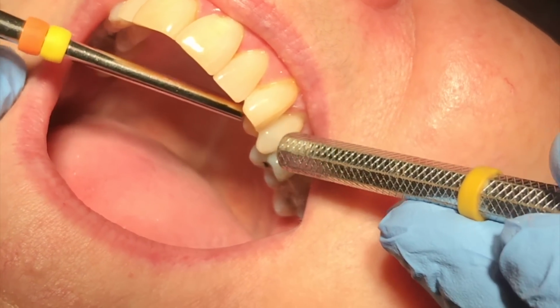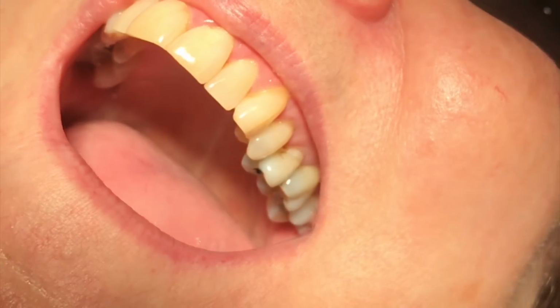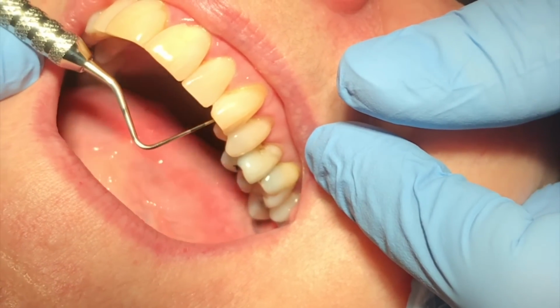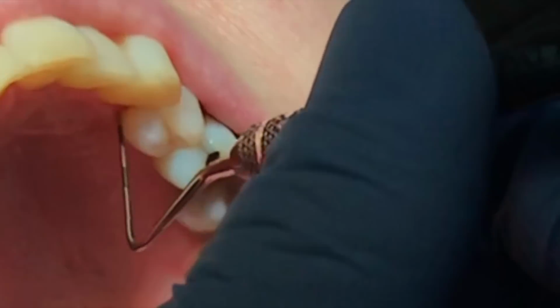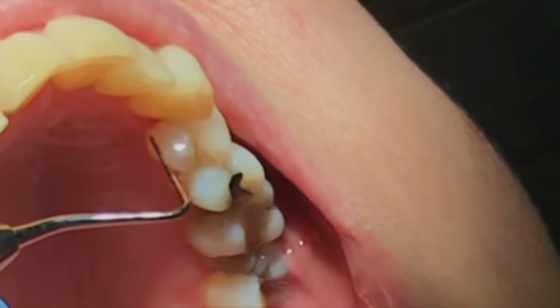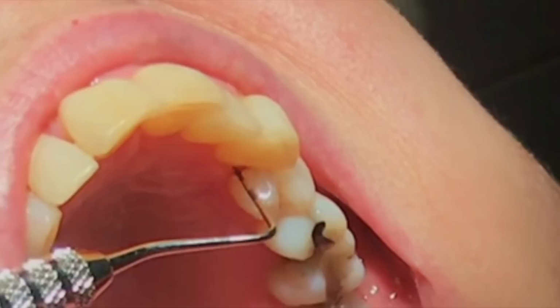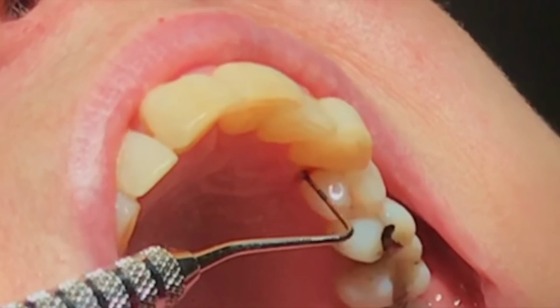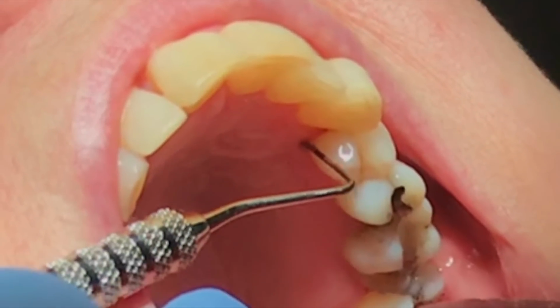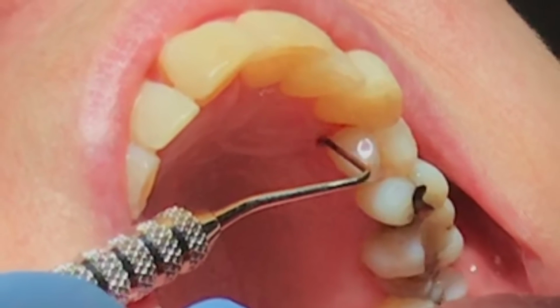Mobility. What'd you say? That's a 2. Then our probing depths. Can you see it right here? Okay, so here I've slowed the probing depths down to 50%, so you can see in slow motion. And right about here, we have approximately a 7mm probing depth without anesthesia.